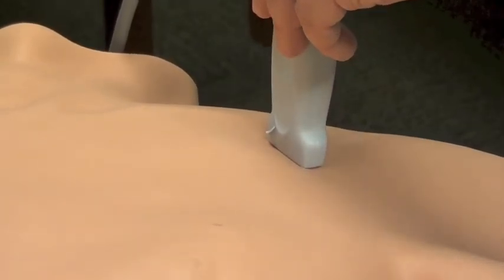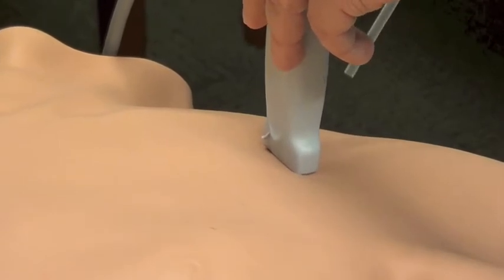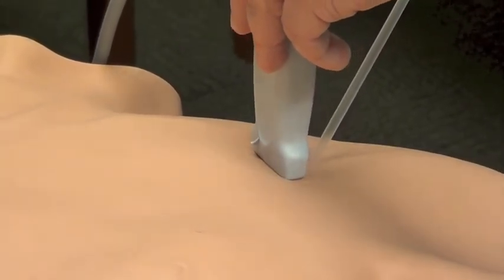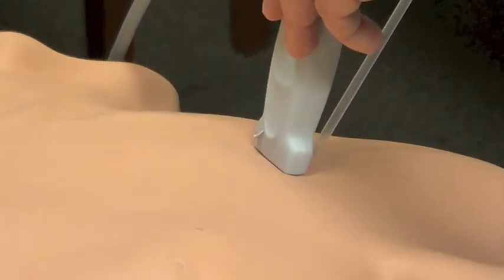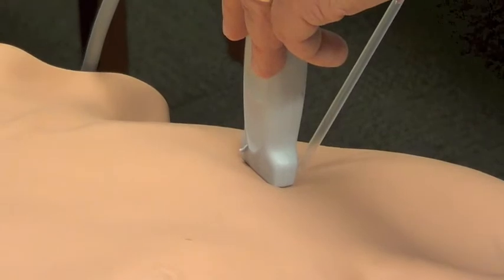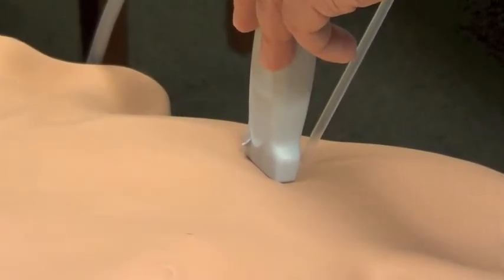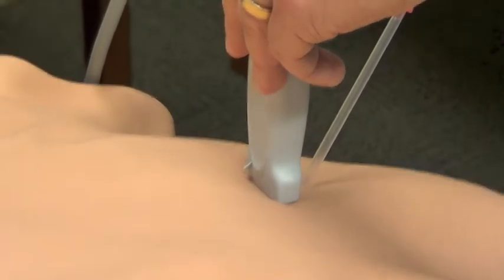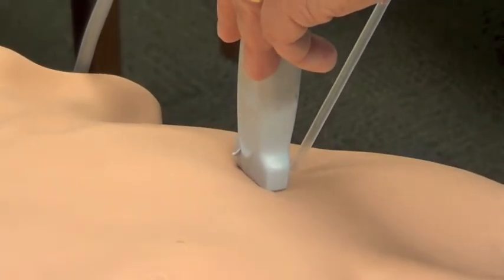So as we insert our needle into the skin we can then fan our probe back and forth to identify the tip. The goal here is to maintain identification of the tip throughout the whole process so that we can see the tip going through the vessel, therefore preventing entry of the tip into the lung parenchyma.